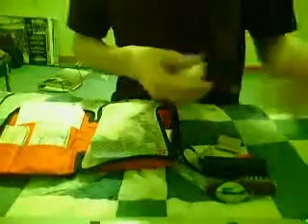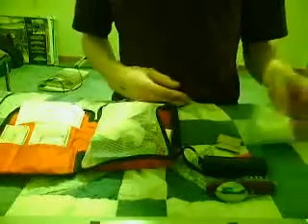And the next thing I have, this came with it actually, is gauze wrap. This is non-sterile. You should never put this on an open wound, especially since it'll be extremely painful when you take it off. Maybe have your non-adherent pad. If I had a cut there, I'd throw that on, wrap it just for a quick fix, and then later on I can put on a more serious bandage.